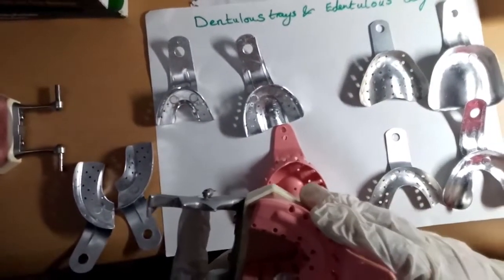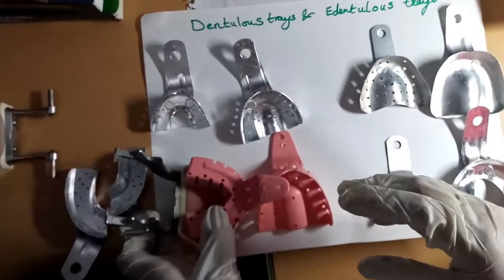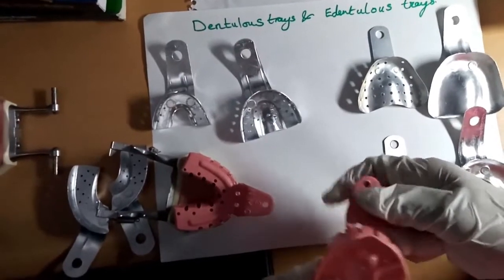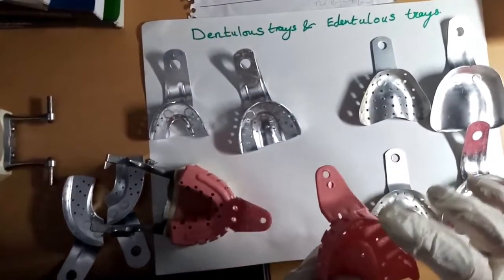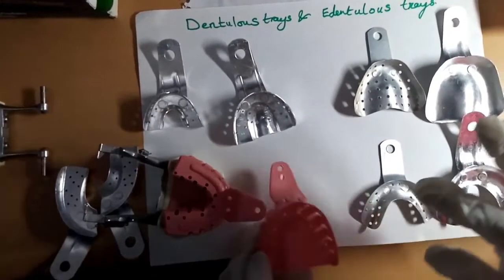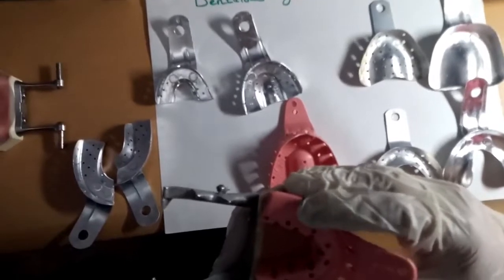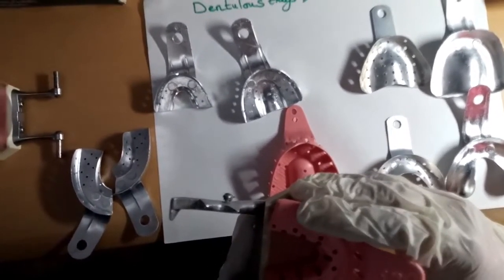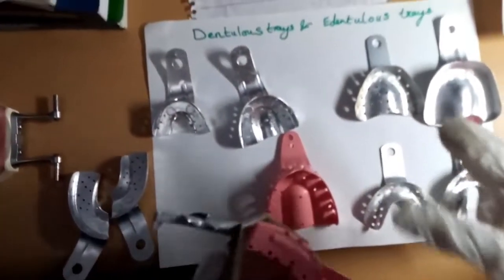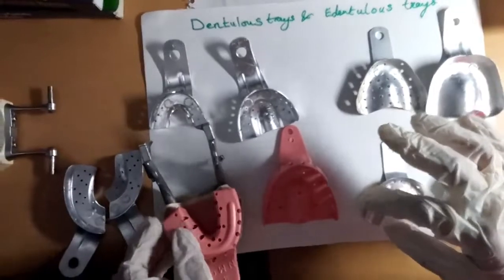So the difference between the maxillary impression tray and the mandibular impression tray: the maxillary impression tray records the upper teeth and the palate. In the upper maxillary impression tray, we have the palatal vault, which records the palate. The lower mandibular impression tray is used to record the lingual area through the lingual flange. There is no vault in the lower, okay? The vault is only found in the upper impression tray.